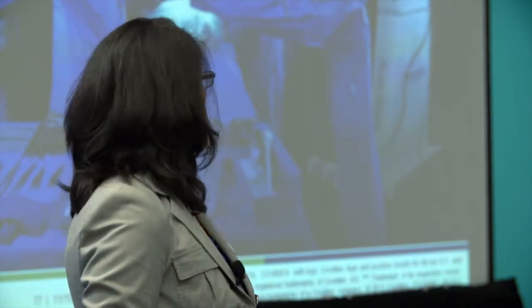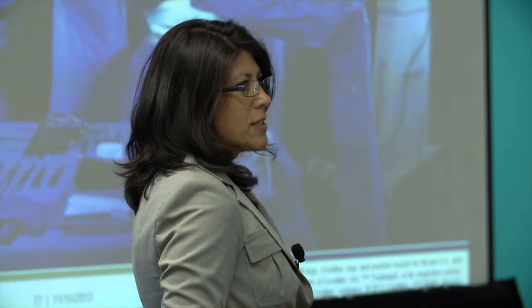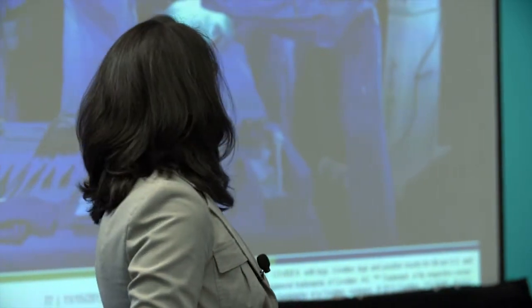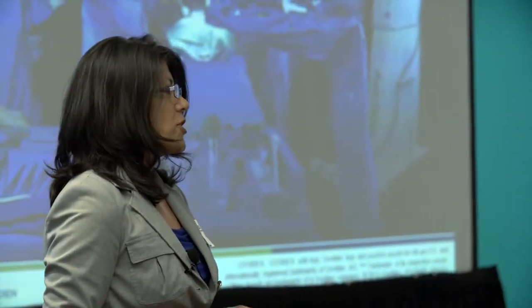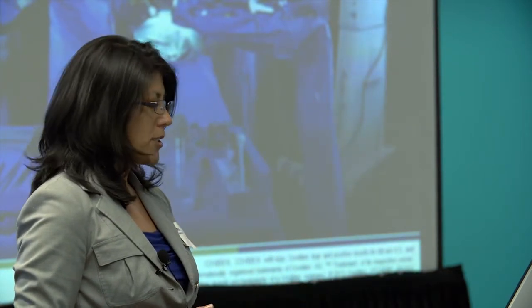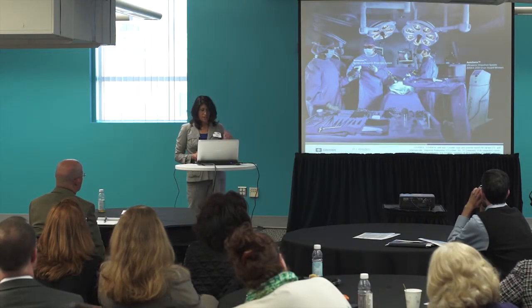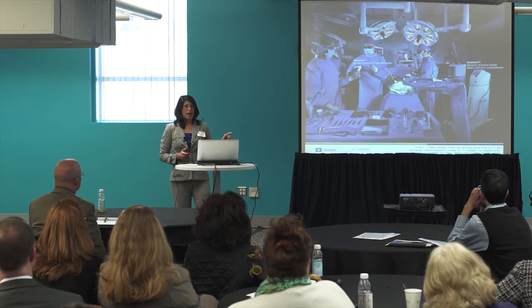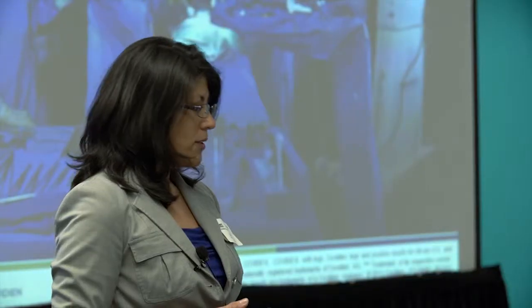For anyone who's not familiar with the operating room or surgical environment, everything in blue is sterile. There are a lot of people involved in the operating room. You have the patient, first and foremost, and then there's a surgeon. The surgeon could have an assist or multiple assists. There's a scrub nurse or a surgical tech who is usually handling all the medical instrumentation. There's an anesthesiologist in the back, and a circulating nurse who is not actually shown, and that person's presence is in the non-sterile field.